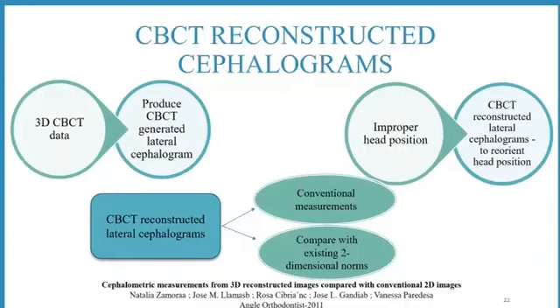In this study, 8 patients were selected. An observer took 10 angular and 3 linear measurements on lateral cephalogram and CBCT on 2 different occasions. The study concluded that no statistically significant differences were found between the angular and linear measurements taken with the lateral cephalogram and those taken with the CBCT.